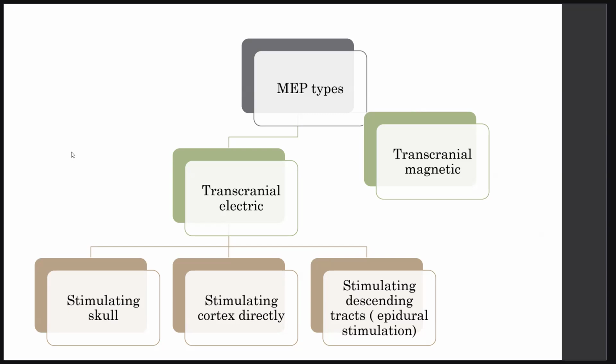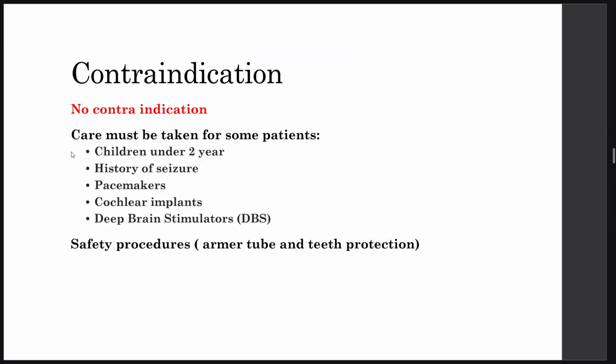Each of them has its limitations, its advantages and its indications. Now, there is no contraindication for motor evoked potential. As easy as that. You should take care of the forceful jaw contraction that occurs during MEP.